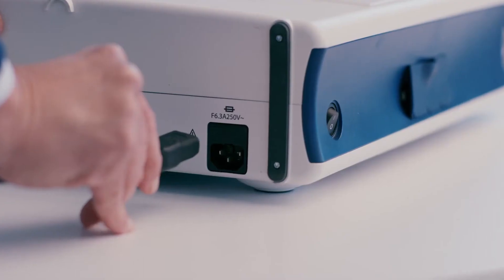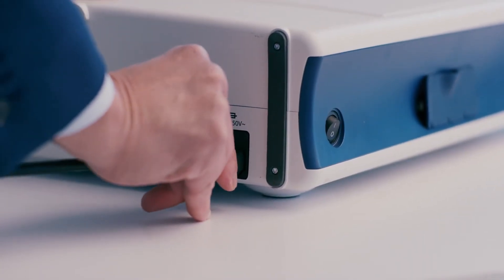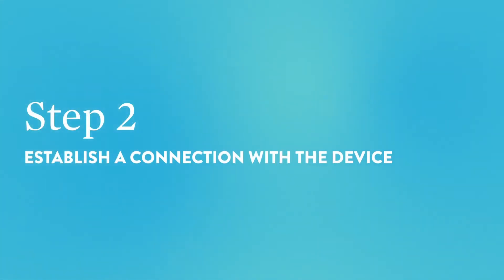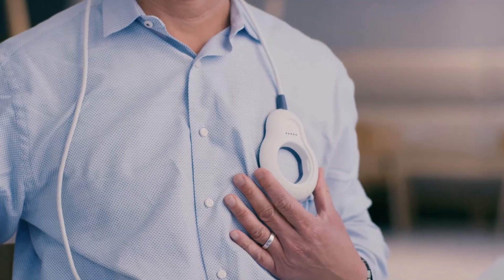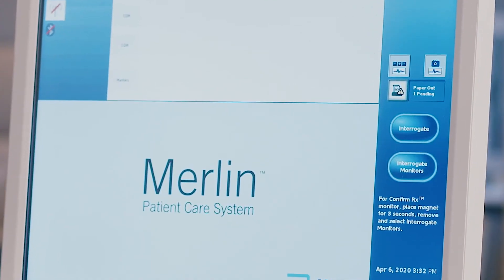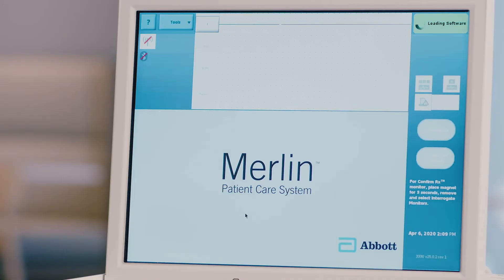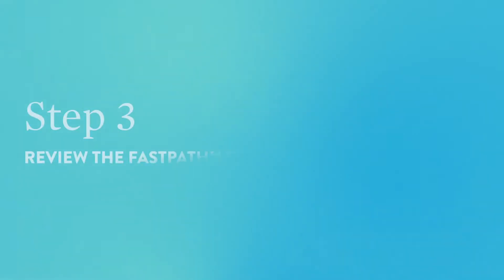Step 1: Power on the programmer. Plug in the power cord and press the on-off toggle on the left side of the programmer. Step 2: Establish a connection with the device. Place the wand over the patient's device and press the interrogate button on the right-hand side of the programmer's screen. The programmer will begin to load the device software, and the upper right-hand corner of the screen will note the progress.